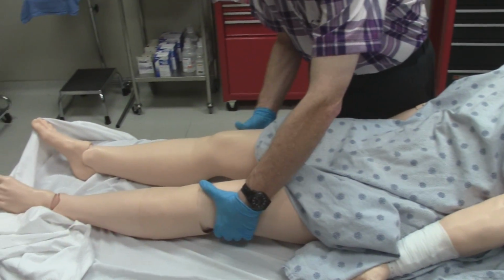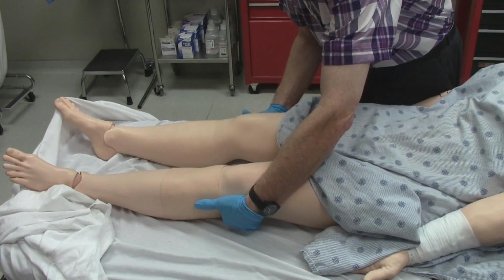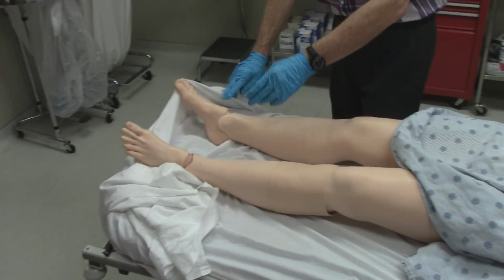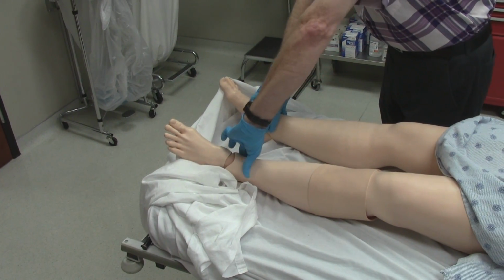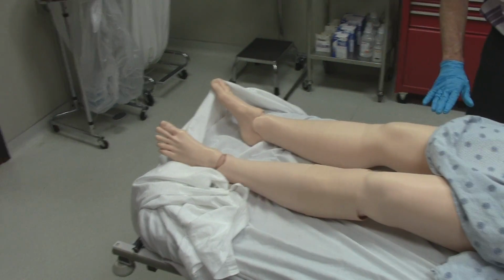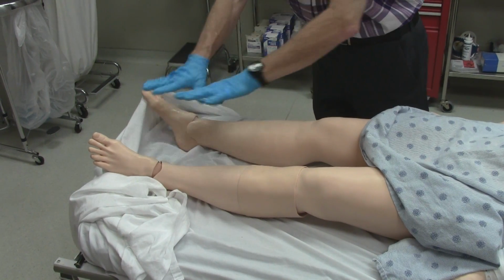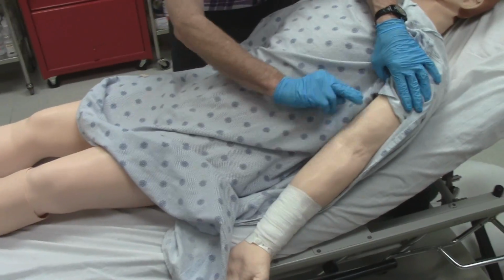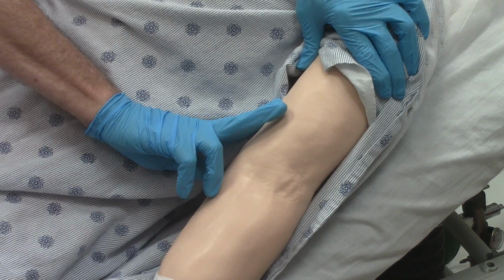The SimMan Essential also has pads located behind the knee where you can feel popliteal pulses, and in the feet there are locations for dorsal pedal and posterior tibial pulses. So you can feel carotid, radial, femoral, popliteal, and dorsal pedal and posterior tibial pulses bilaterally. There also is a brachial pulse. That's in the patient's left arm only.